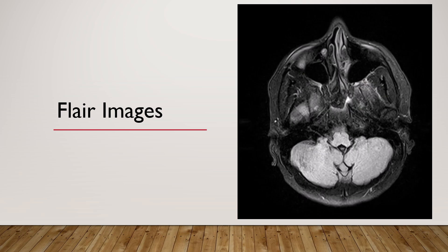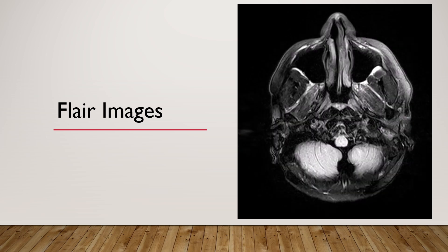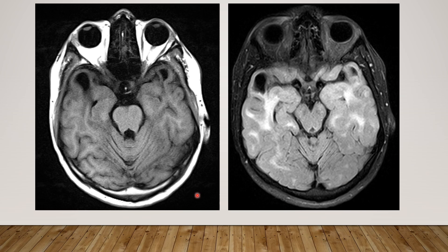There are subcortical cysts in bilateral anterior temporal and frontal regions. The cerebellum and brain stem are normal. Here we can see the subcortical cysts in the bilateral anterior temporal region. The pons appears normal.